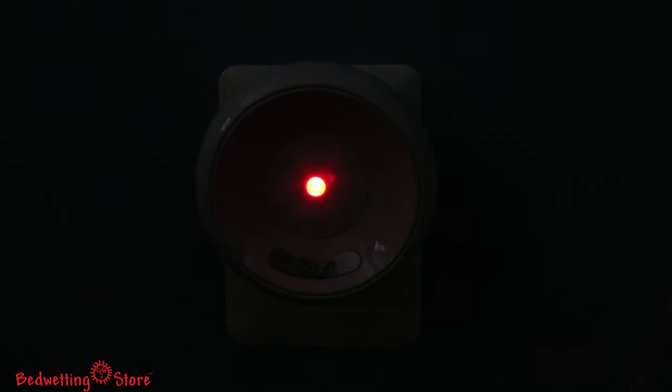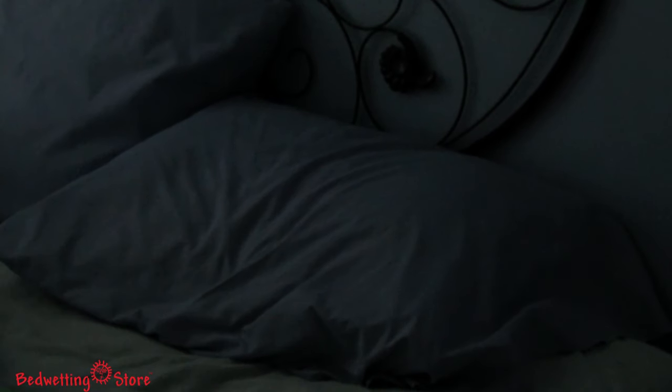As the alarm goes off, the receiver's LED button will flash red. Your child will have to get out of bed to press the button to stop the alarm. This will help him learn to get up in response to wetting the bed.